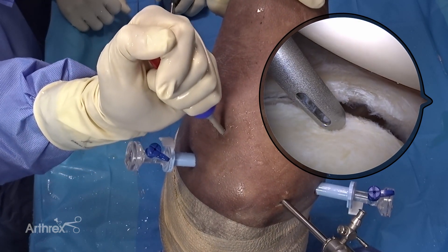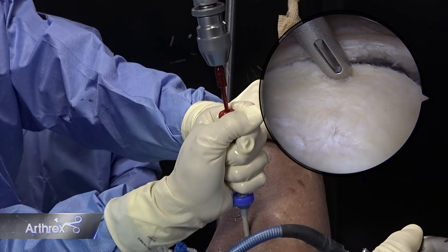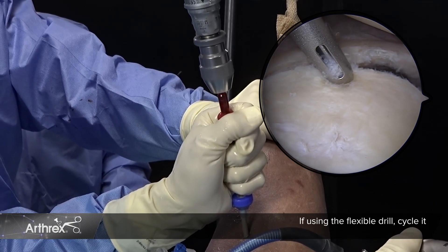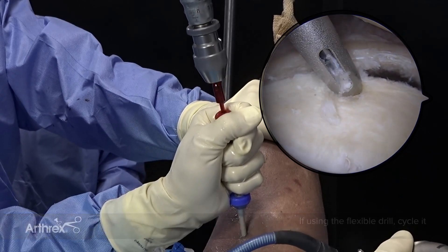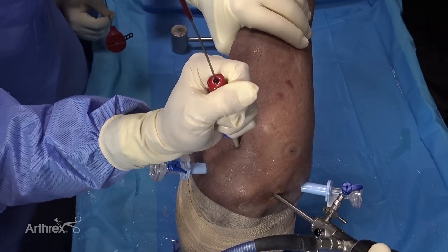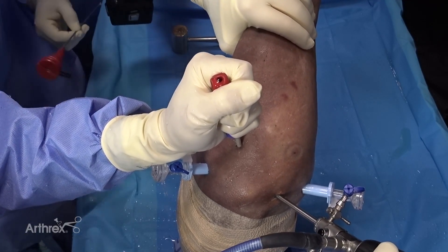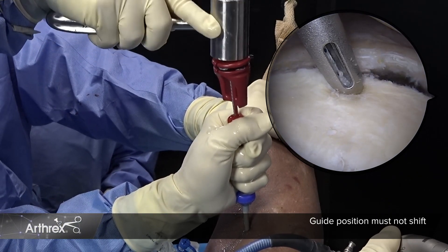I'm going to gently lever the humeral head to achieve the optimal angle for drilling. During drilling, I recommend cycling the drill in and out of the bone to completely remove any excess debris. This permits easy insertion of the anchor, as well as allowing the sutures to slide without tension for easy shuttling and tensioning. I highly recommend that the surgeon holds the drill guide and the assistant drills and places the anchor to ensure that the drill position does not shift between drilling and anchor placement.